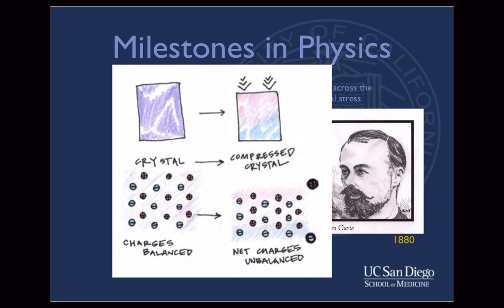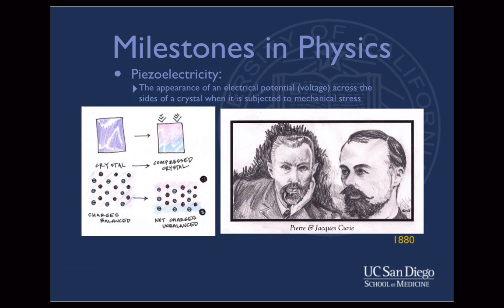The crystal has atoms arranged in a very orderly fashion. Although the arrangement of these atoms is asymmetric, the overall electrical charges within the crystal are electrically neutral. When the crystal is compressed, the net charges become unbalanced, releasing an electric potential. Positive and negative charges appear on opposite ends of the crystal. This is a demonstration of the piezoelectric effect.